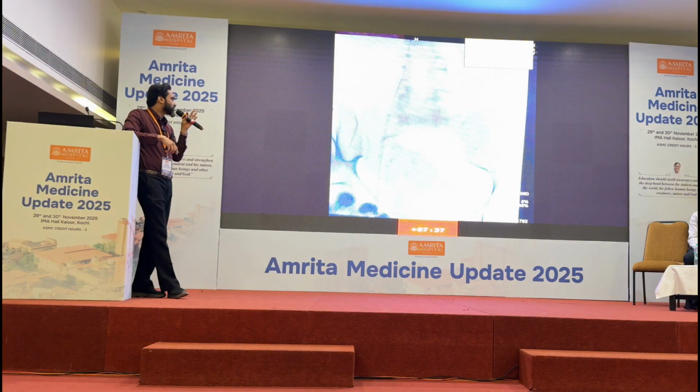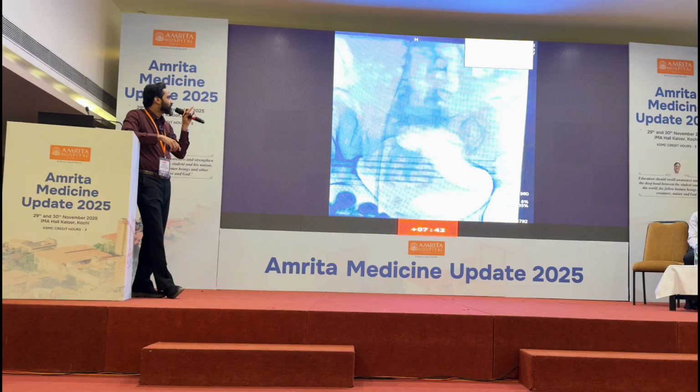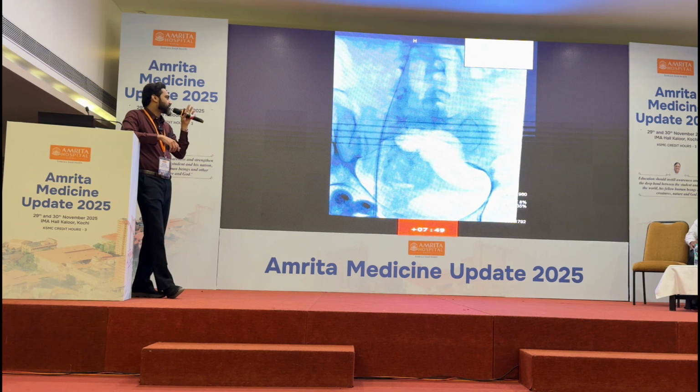So we went in with our snare. We caught hold of the tip of the J wire, and this is what we did. This is a 5 minute job for us. We took out the wire and she was rescued.